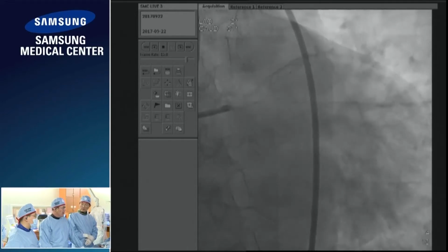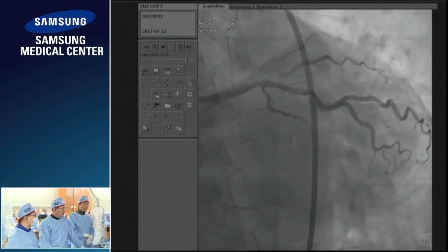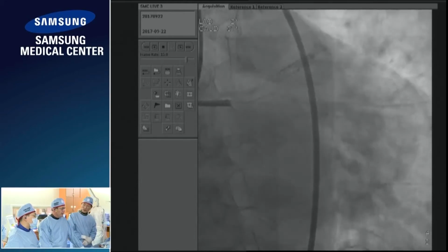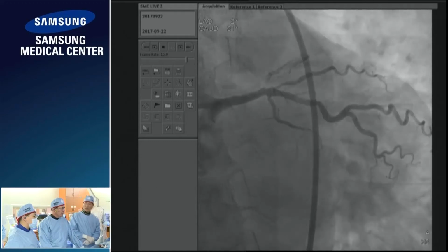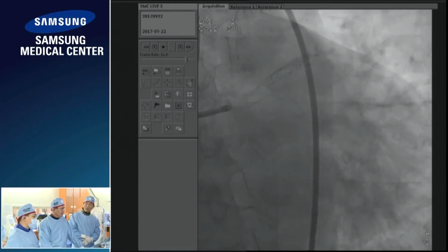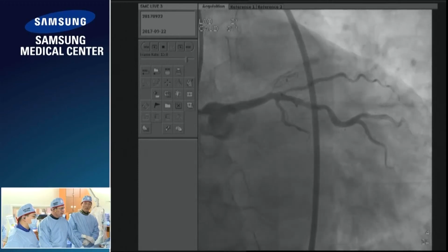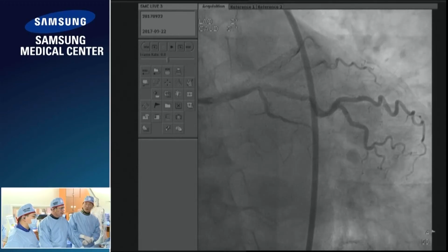It may not necessarily be a primary stent failure. Some recanalization after 2 or 3 weeks means that there are some thrombus or plaque rupture mechanisms working here. So we need to be concerned about some distal embolization, or that organized thrombus may be at work.